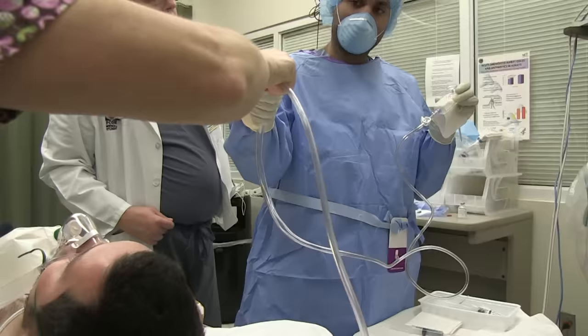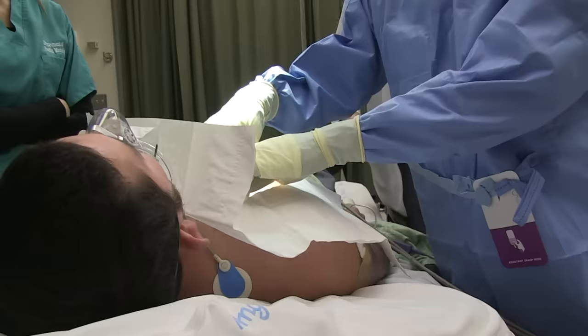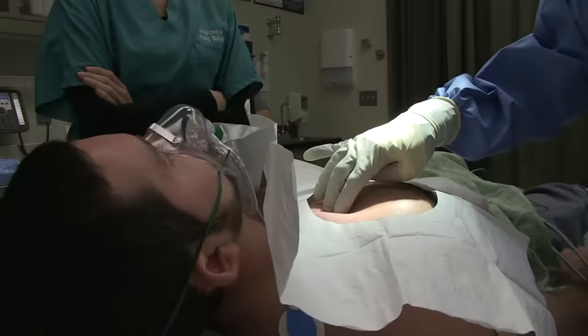I can hand it off to you. Okay, so everything is prepared. Our suction is prepared. The patient is prepped currently. We're not going to anesthetize the area yet. We're just feeling for landmarks at this point. We have the clavicle and first rib, and then we're moving down into the second intercostal space right here. That's where we'll be introducing our needle and our trocar. You doing okay there, my friend? Yeah. All right, sir. Just relax.